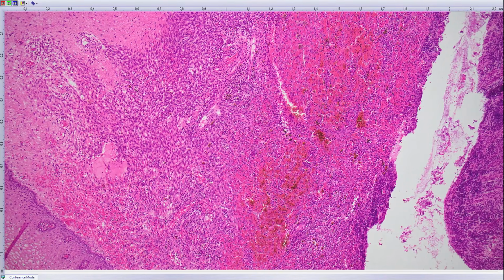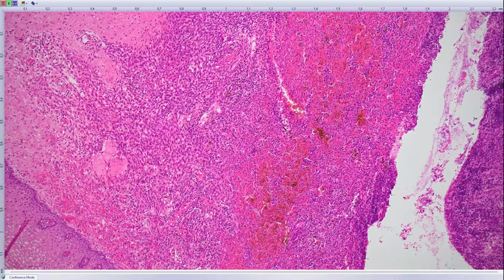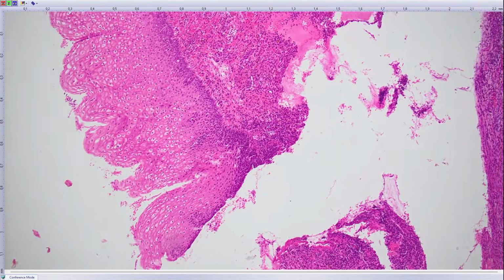I'm not sure whether it's the right name because I think it's reactive, but you never find glandular differentiation in these lesions, and especially they should be distinguished from spindle cell sarcoma, especially rhabdomyosarcoma, especially those arising in DICER1 mutation syndrome. These are innocuous, they mean nothing, they do not do anything. One sign is that you can always find reactive lesions in the superficial epithelium of it.